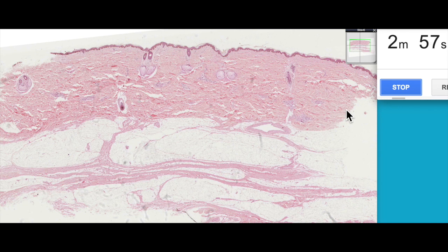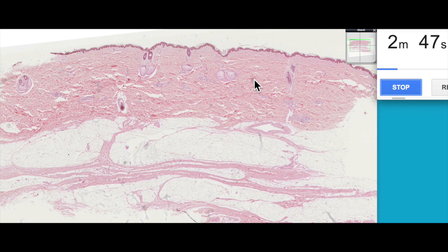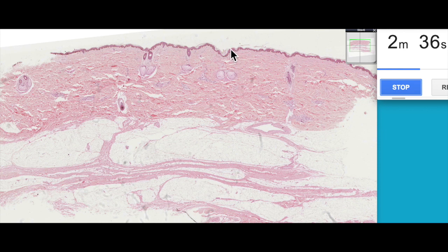The integumentary system we often just think of as skin, but of course it's other structures as well. The integumentary system, certainly in this section, can be divided into three main layers. The first of the layers is the epidermis, which is the outermost layer of epithelial tissue. It's made up of a stratified squamous keratinised epithelium, and that's this layer here.